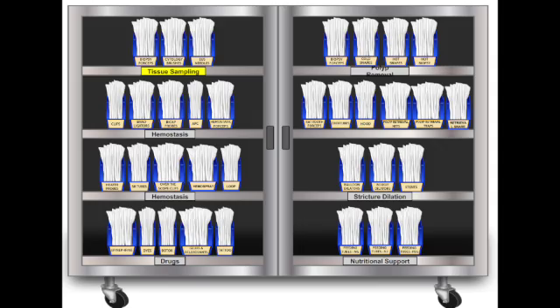And you mentioned another use. Yes, critically, remember it can also be used for venting. If a patient has an obstruction, maybe from a tumor, and they're vomiting constantly, a PEG can be placed just to drain the stomach contents and provide relief, even if they're not being fed through it. Good point. Dilation next. Widening narrowed areas.